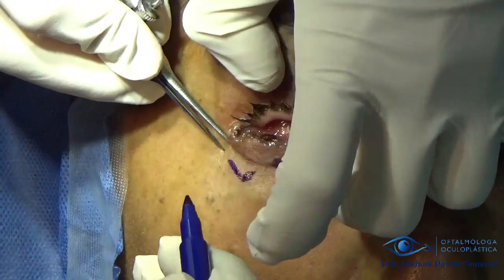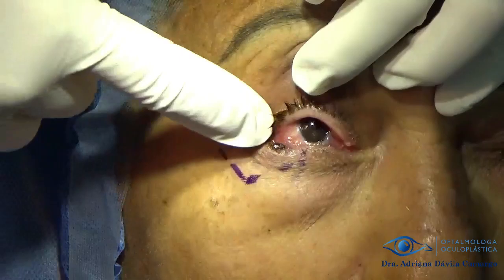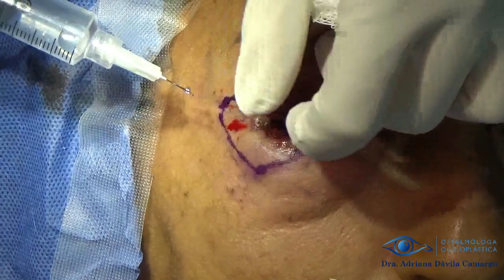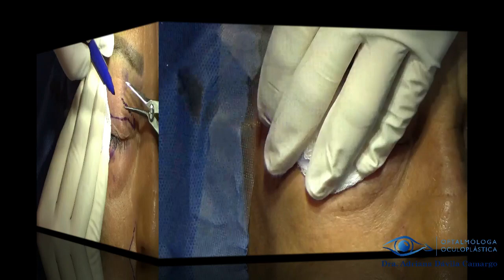We begin by marking five millimeters from the tumor to do our resection and infiltrating with local anesthesia. We can do the surgery with local anesthesia and light sedation.